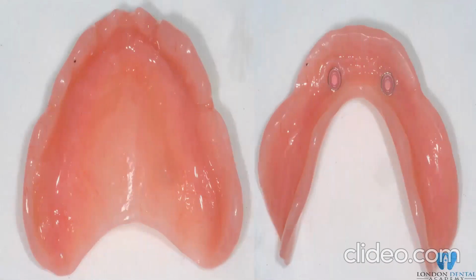So let's move on. We are spending a lot of time on these things, but I'd like to highlight these patients coming through the doors with these dentures, and we call them the inserts. We have a metal housing, which has been acrylic processed during the flasking stage, and never put them in cold cure unless you are happy with the dentures, and I will probably explain that in detail later technically. If you've got dentures nicely processed and you're happy with them, you can add them chairside with cold cure acrylic, but send it to the lab for finishing and polishing at the end. You don't get a weak link or bonding.